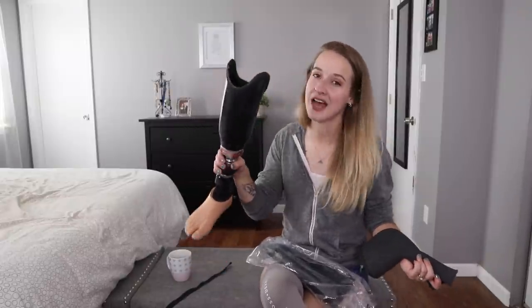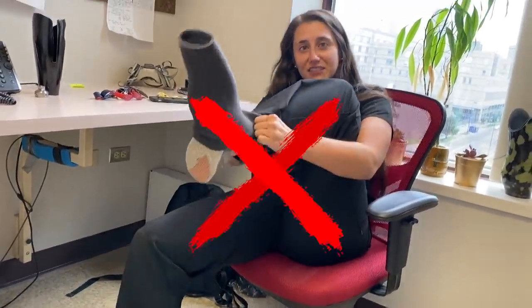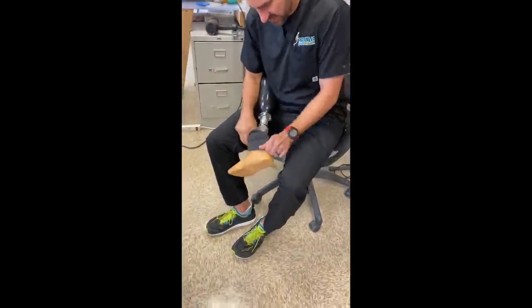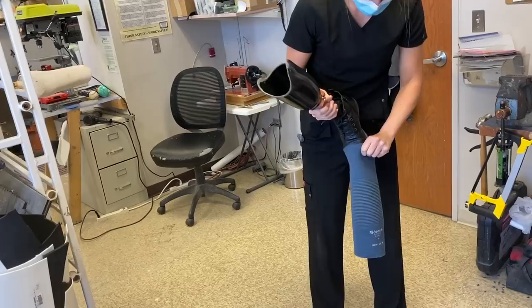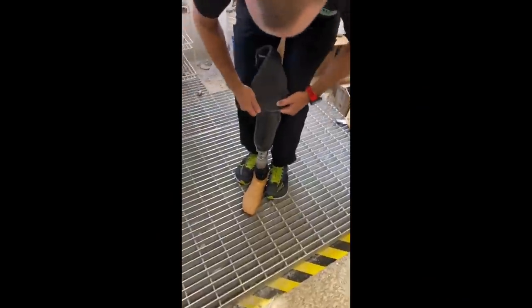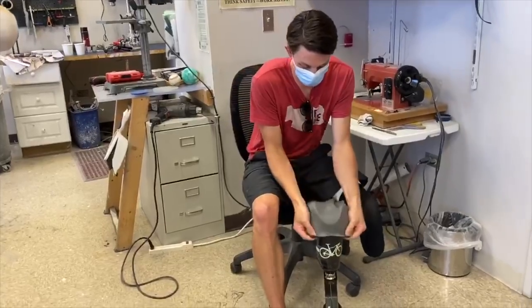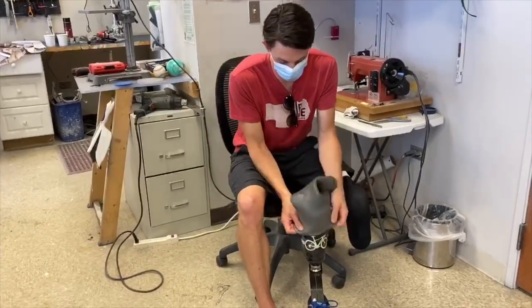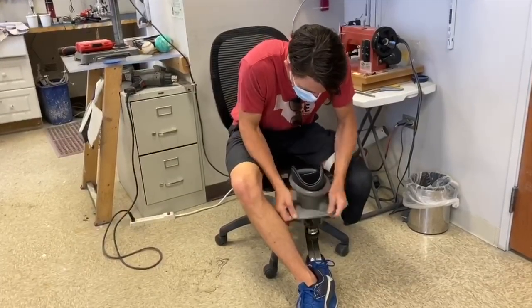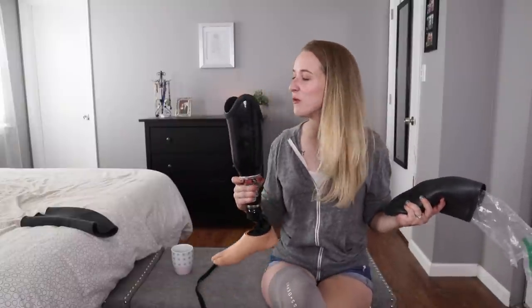If you have a foot, don't put on your suspension sleeve like this. Another way not to put it on. So folks, that is not what we are going to be doing today.